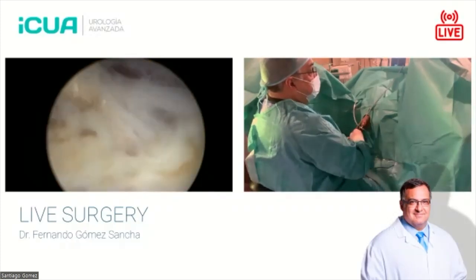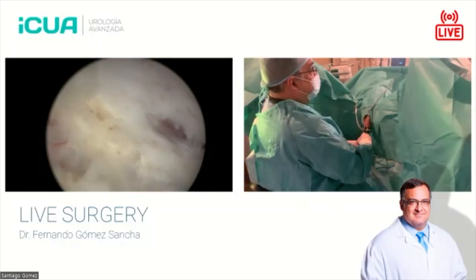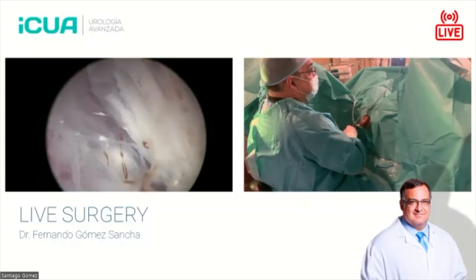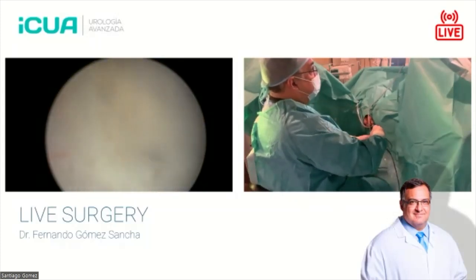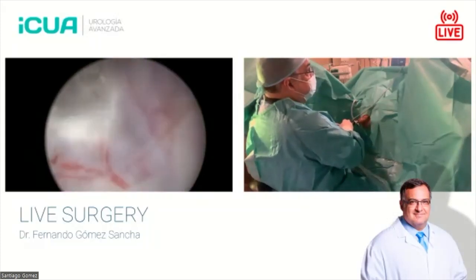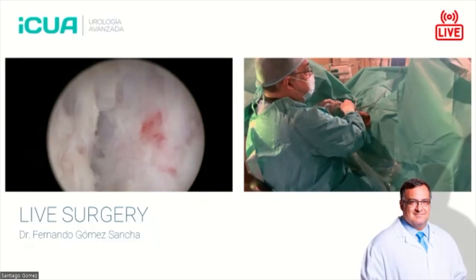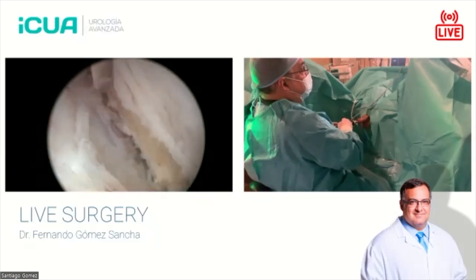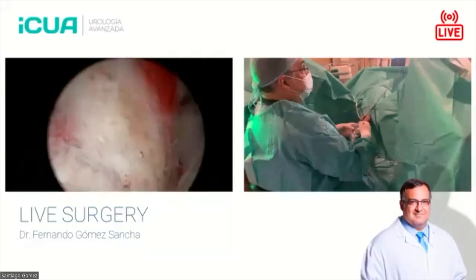And now you'll see the magic taking place. Here, I'm trying to, you see, follow my line. This is lateral line, and this is now becoming anterior line. So here, I also want to connect properly to the anterior line. Lateral line, coming downwards. Okay, so at the end of this apical liberation, we should have a very clear line that goes all around the adenoma. So what happens if we come here towards 12 o'clock?